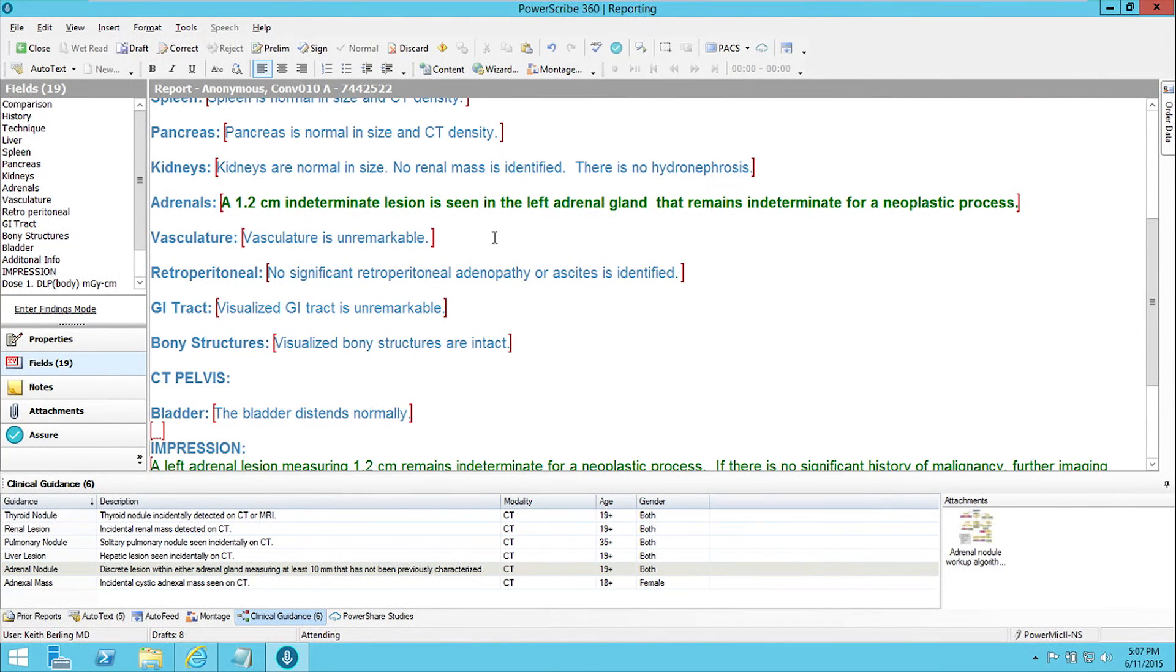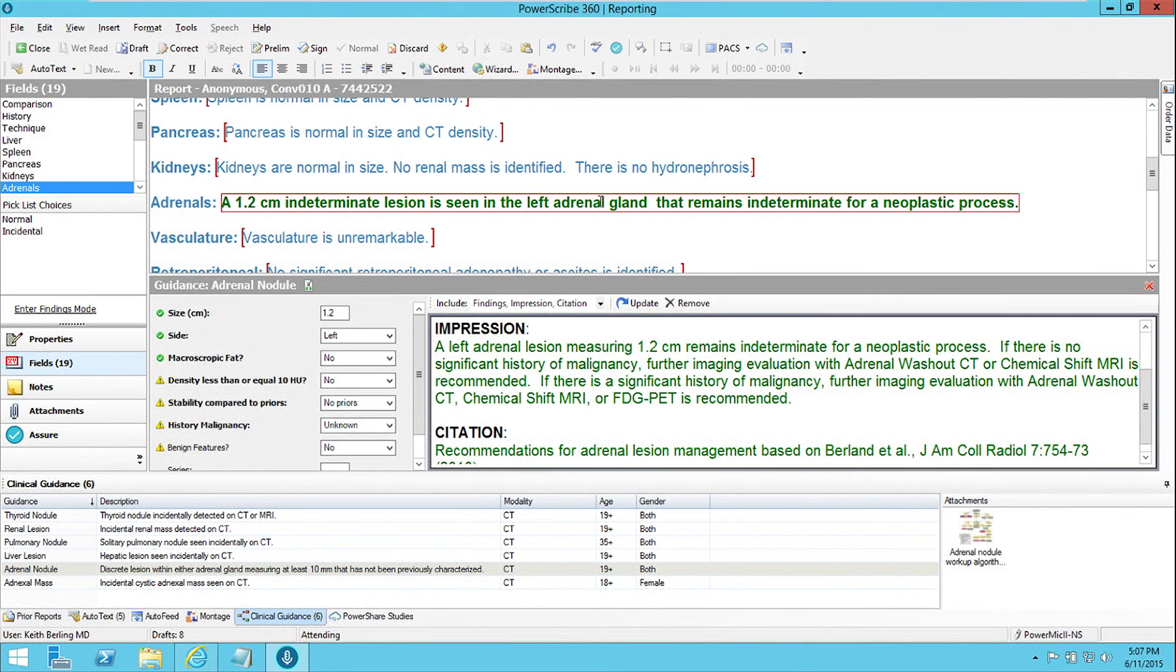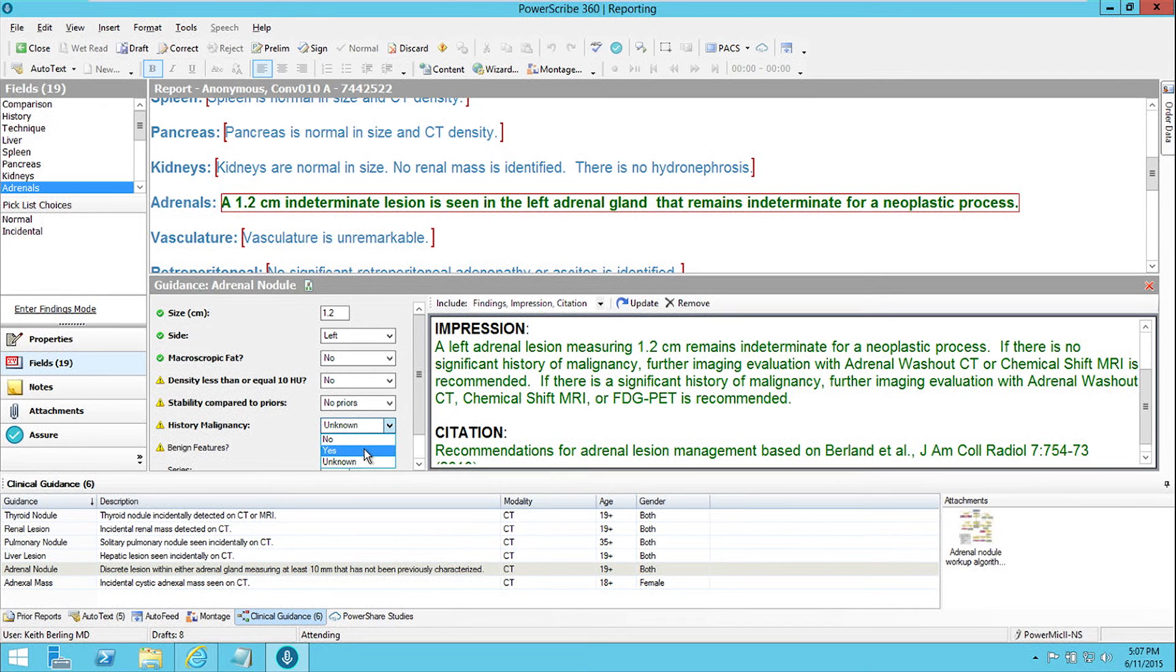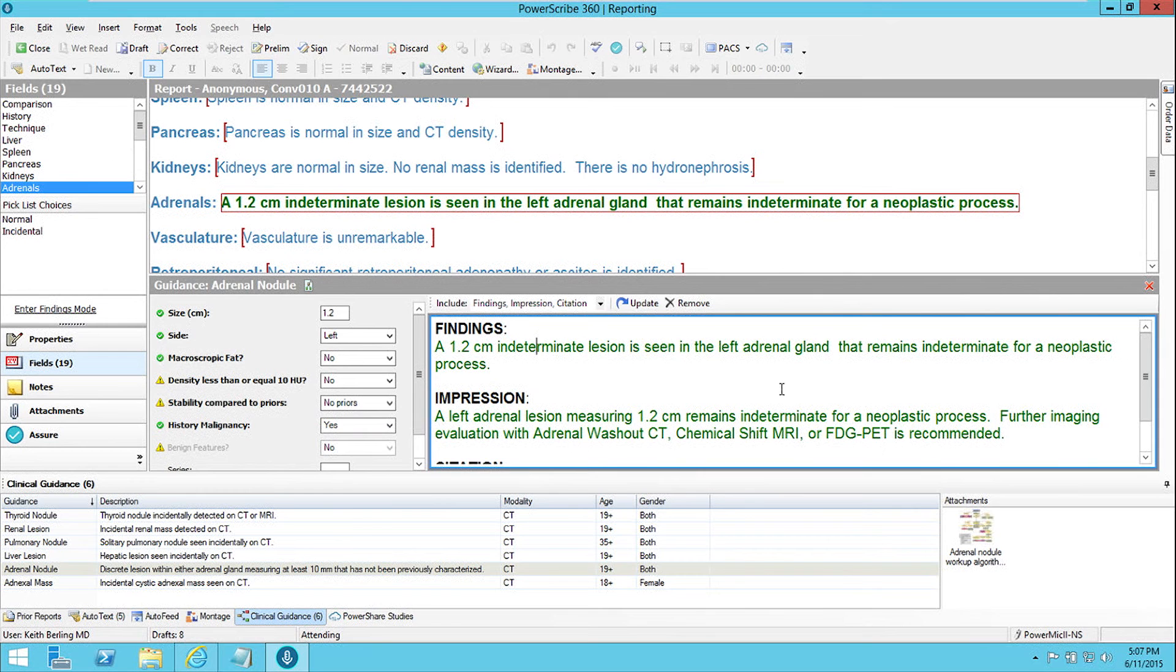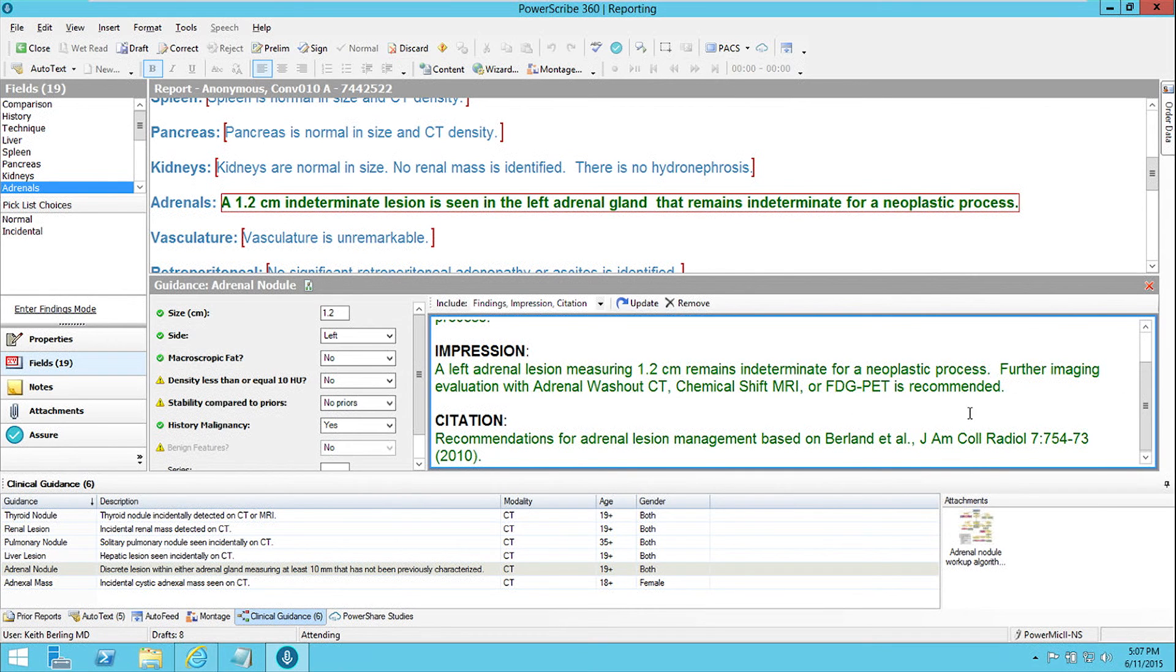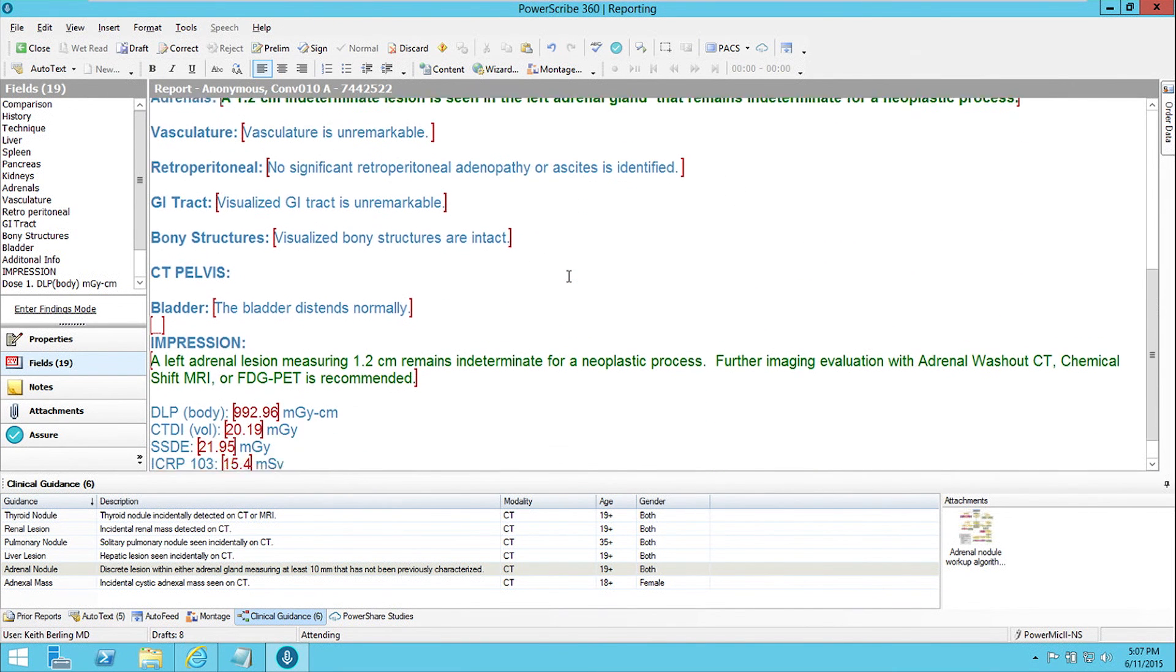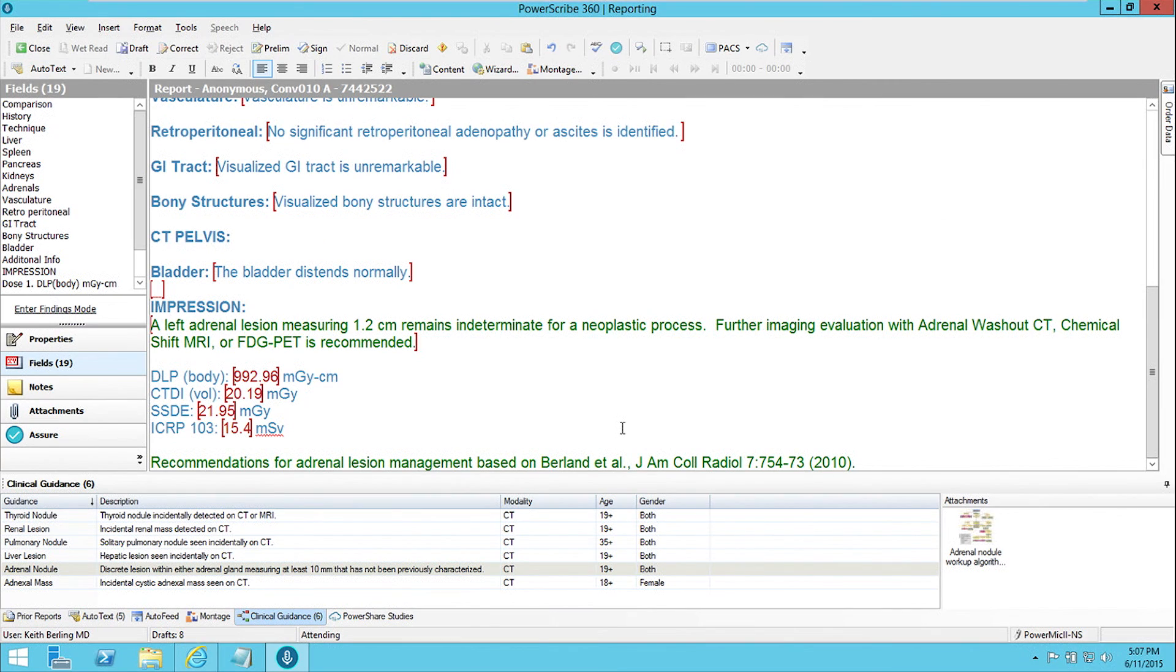And if I need to make a change to it, for example, I get more information about the lesion or about the patient, I just click on the description of the text, and I can go and say, oh, actually this patient has a history of malignancy that we know about. And so I click yes on the history of malignancy, and it updates all of the text so that it says that further imaging evaluation with adrenal washout CT, MRI, or FDG PET is recommended. And then I click update, and it makes the changes to all of the inserted text that it had made and keeps it all consistent with one another.